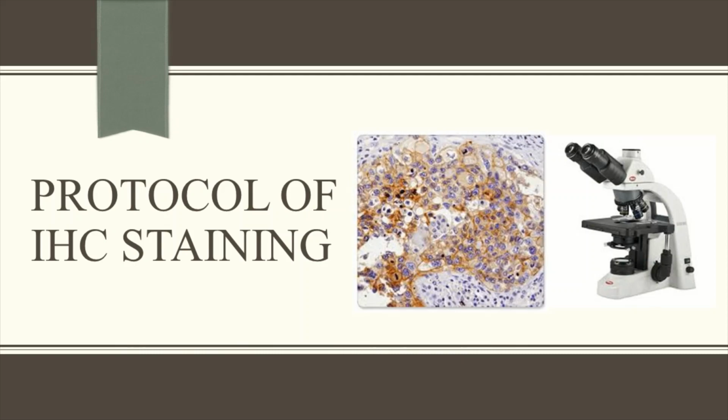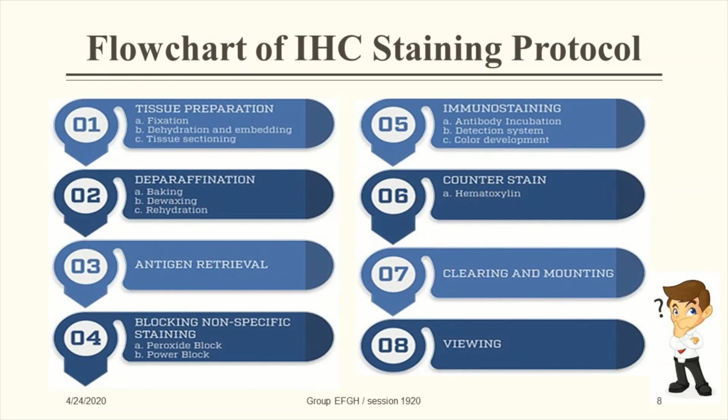Upcoming is the protocol of IHC. Following is the flow chart of the IHC staining protocol. The IHC staining procedure covers from sample collection to final visualization and involves 8 steps as shown.